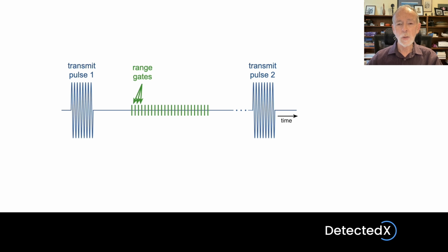Then, of course, the machine waits until it's okay for it to transmit again, and it transmits the next pulse and repeats that process. But remember, only around 8 times before it moves the beam to its next position and starts again.